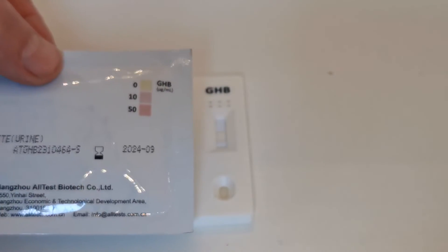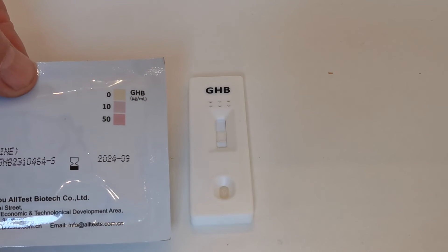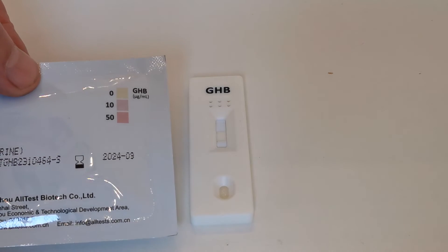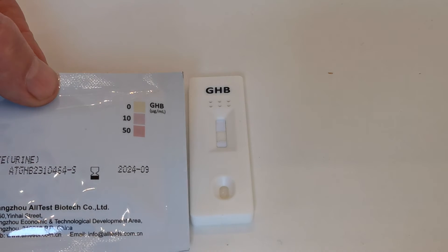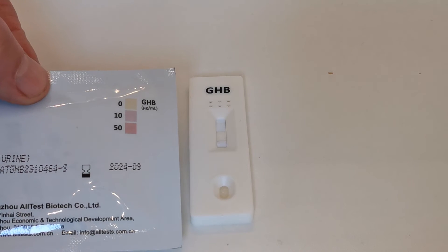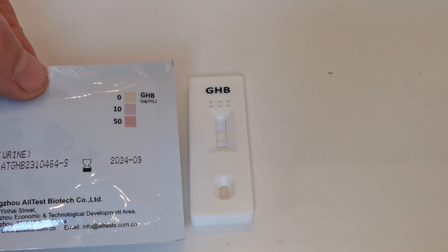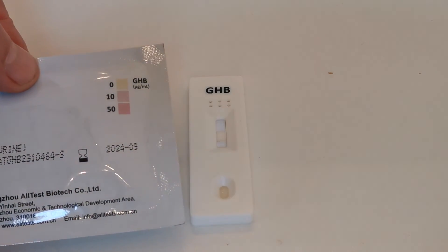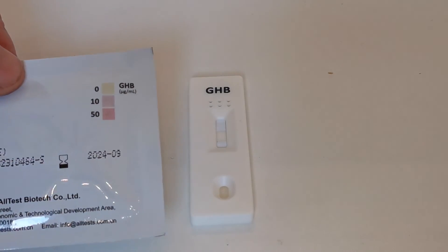This is the comparison chart that you work with. You can see it's a darkening shade of pinky-mauve that occurs with higher concentrations of GHB in the sample. The lighter shade corresponds to a concentration of 10 micrograms per mL, the next shade to 50 micrograms per mL, and shades beyond that indicate higher levels of GHB. However, at ten minutes the quantitative determination is lost.